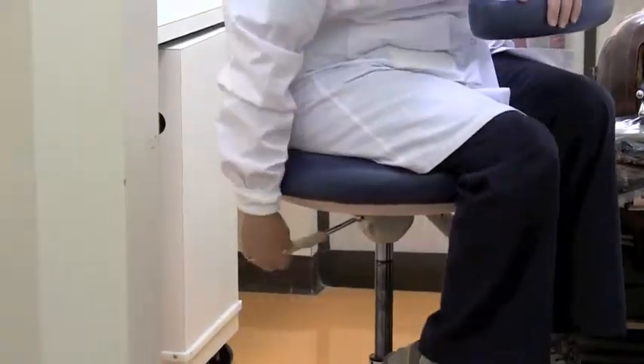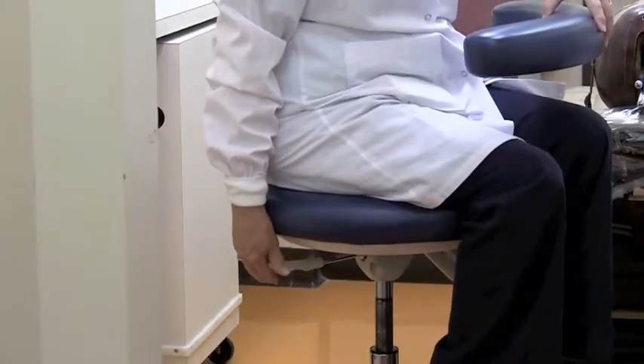To adjust the chair height, take a seat. Pull up on the lever and with your weight, allow the chair to either move up or down.